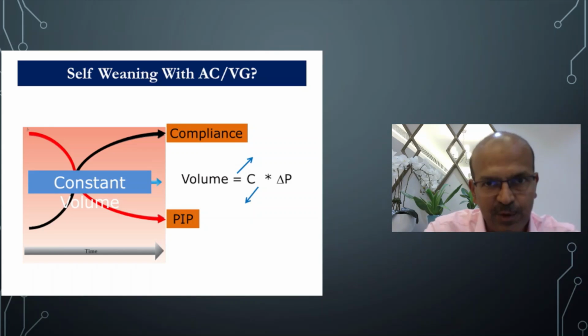As I said earlier, if you are using the right pressure, if you are not over ventilating the baby, you have to judge what pressure is needed, and that's where our previous experience with using these modes helps us as well. So the newer generation as well, try to look at the babies, what pressure they're needing on volume guarantee, so you get an idea of the pressure that is acceptable for that baby size and disease.